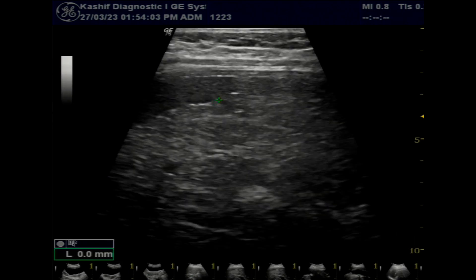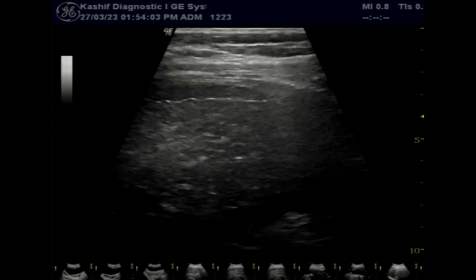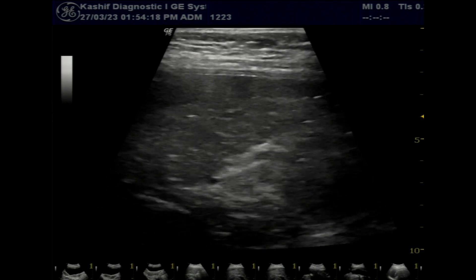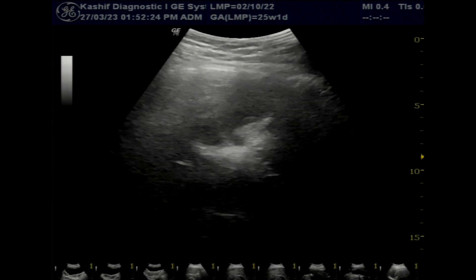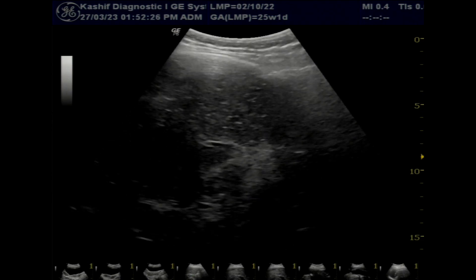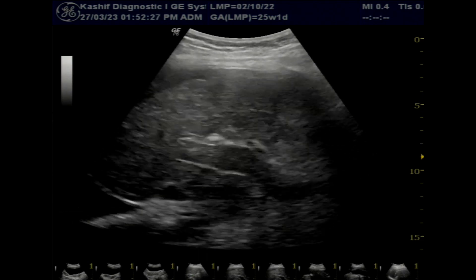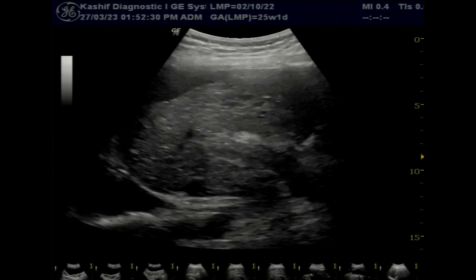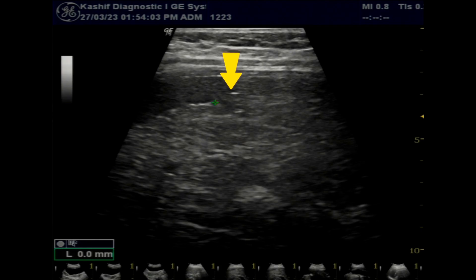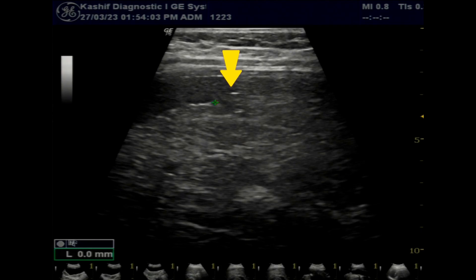Small regenerating nodules are common in liver cirrhosis — these are microscopic (less than 3 millimeters) and macroscopic (3 to 10 millimeters). However, in this case the nodule is mildly atypical with some bulging from the inferior surface, and needs to be further evaluated. Liver malignancies are strongly associated with cirrhosis of the liver, and hepatocellular carcinoma is the fifth most common cancer in the world.